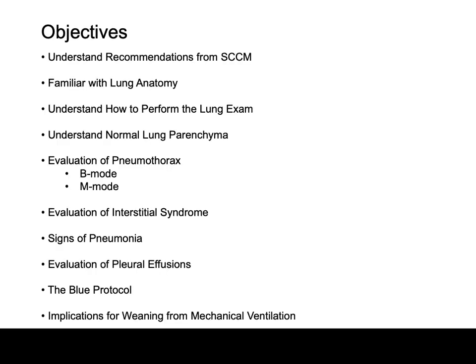By the end of this presentation, you should understand the recommendations on lung ultrasonography from the Society for Critical Care Medicine, be familiar with lung anatomy, understand how to perform the lung exam, understand normal lung parenchyma, evaluate pneumothorax using B mode and M mode, evaluate interstitial syndrome, understand the signs of pneumonia on ultrasound, evaluate pleural effusions, have an understanding of the Blue protocol, and have a basic understanding of potential implications using lung ultrasound for weaning from mechanical ventilation.